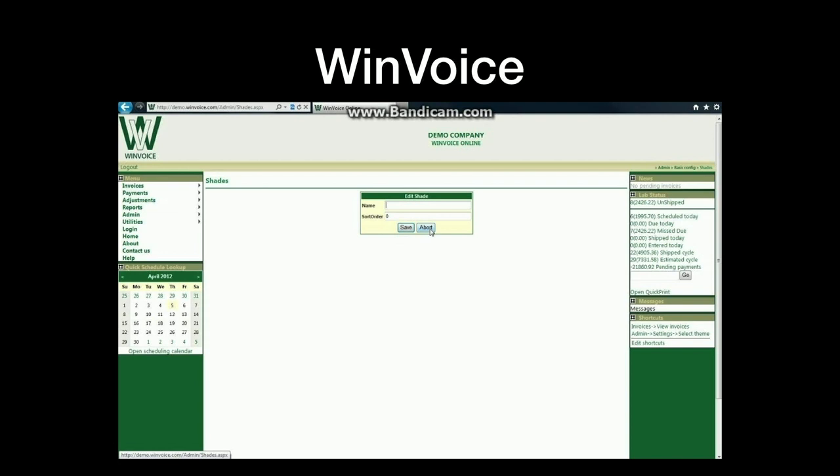It's a web browser, and you got your lab status, scheduled today, due today, missed due, all that stuff, and then you have invoices, payments, reports, so you could actually bill out your invoices and stuff like that. You just logged in like you would your email. It was cool. So as you can see, digital to me starts with the software.